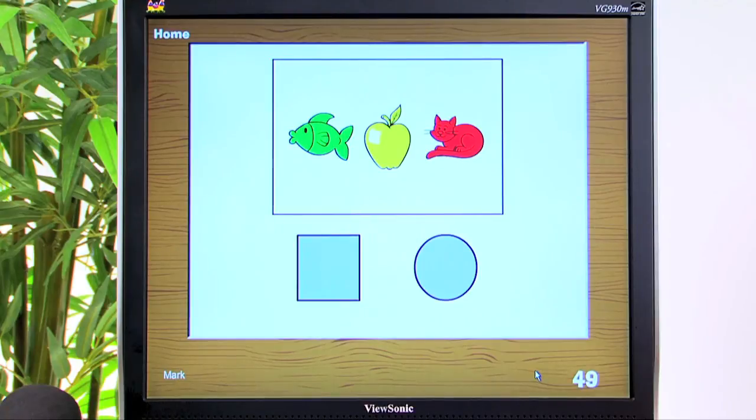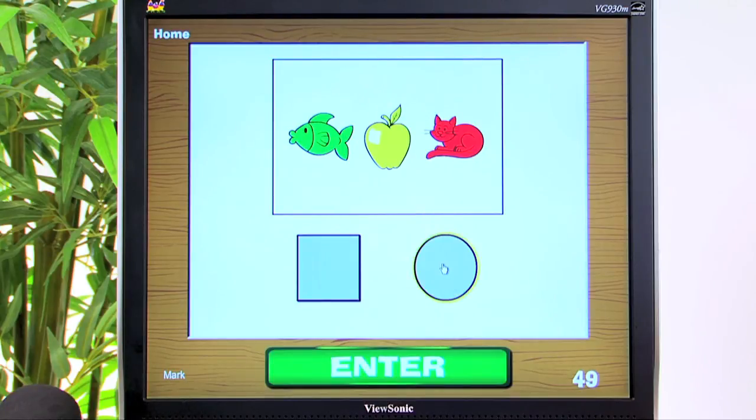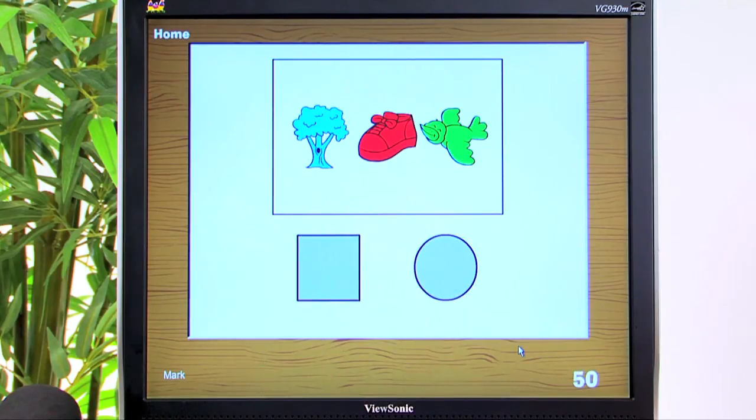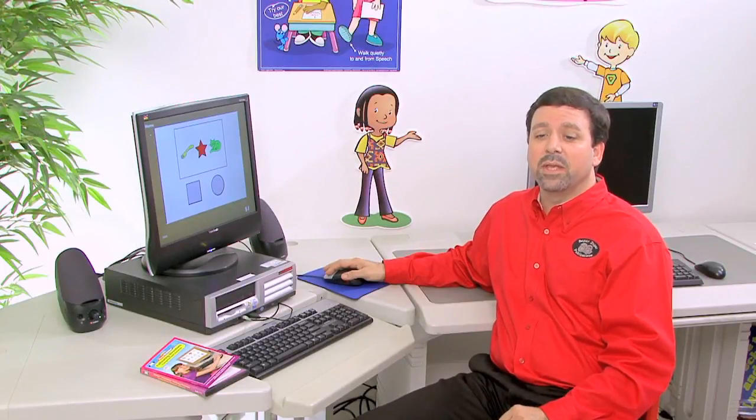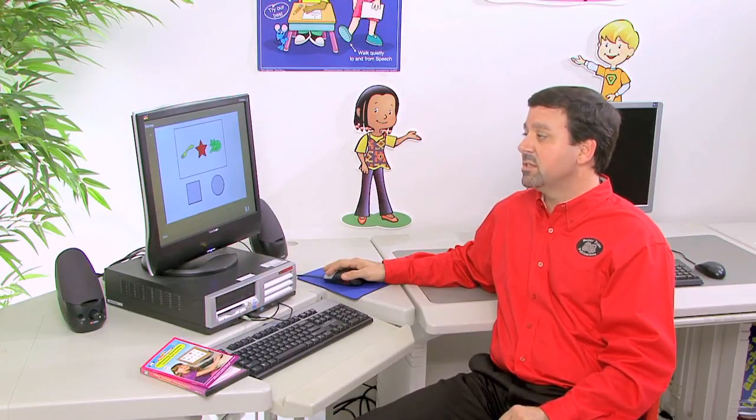If a fish is in the box, click on the circle. If not, click on the square. If a red bird is in the box, click on the square. If not, click on the circle. And those are just a few items from the Conditional Directions subtest.